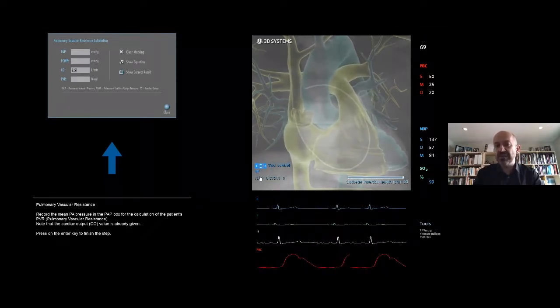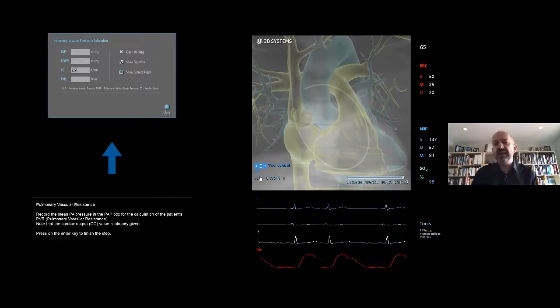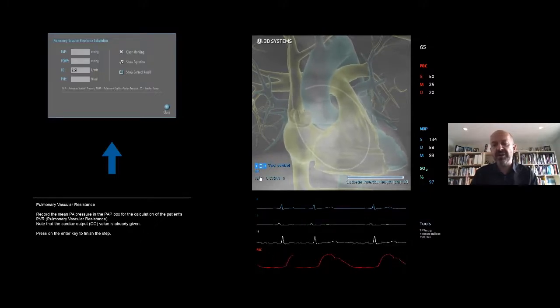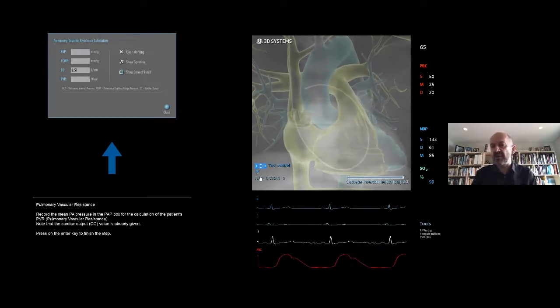Take a look at the inferior vena cava, right? So if you were to do this from the femoral vein, which we do in the cath lab, it is really tough to make that turn. See, that turn from the RA to the tricuspid valve and then up and around into the pulmonary artery, it's not that easy to do. You need fluoroscopy, and it takes some hand skills, eye coordination to do this.